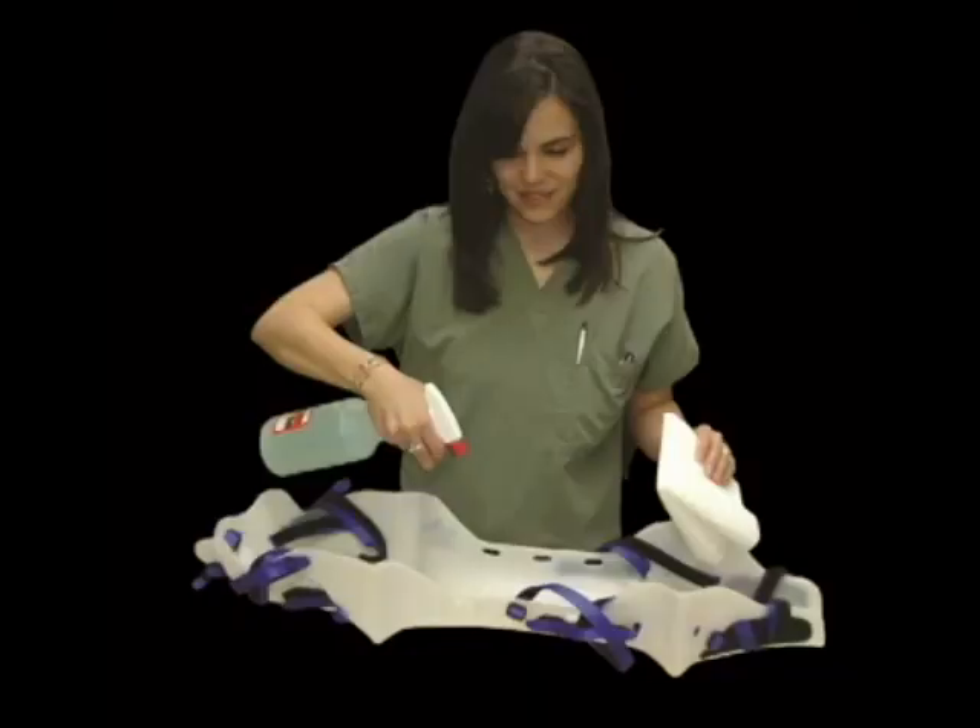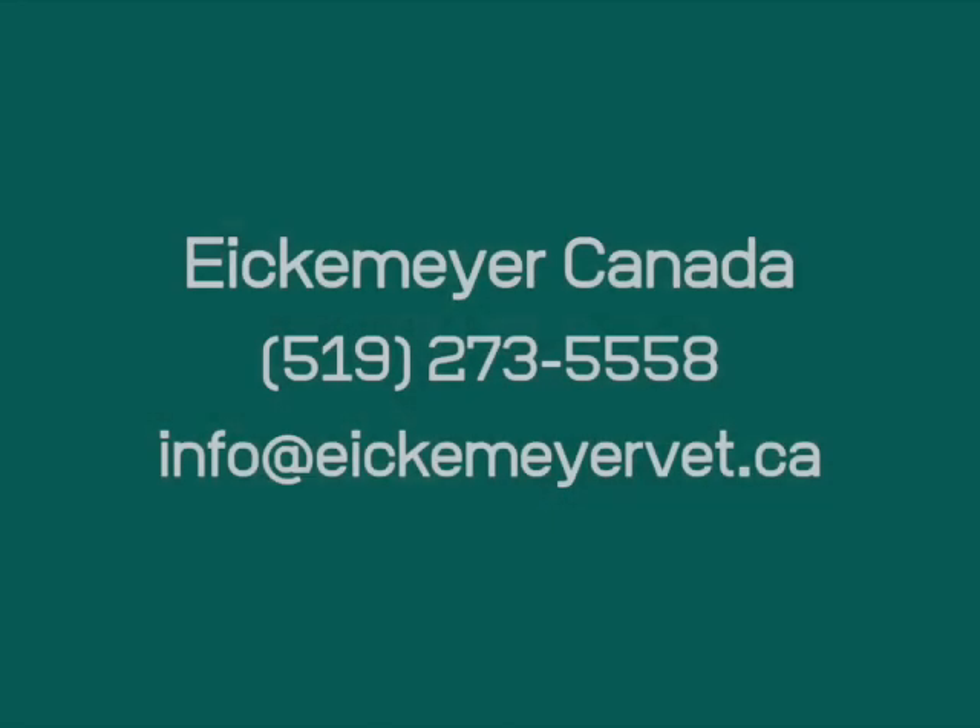The cradles can be cleaned with any common veterinary disinfectant, and conveniently placed back on the included wall hanger for easy access and storage. Concerned about durability, the Positioner was made in the USA and built to last a lifetime.